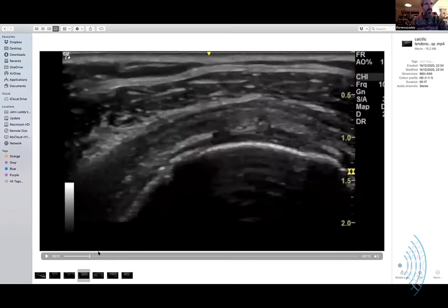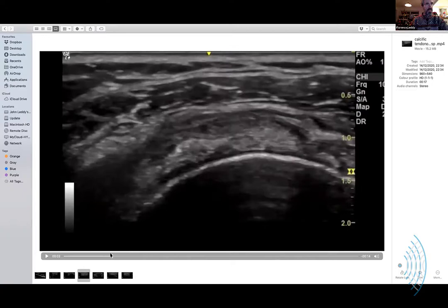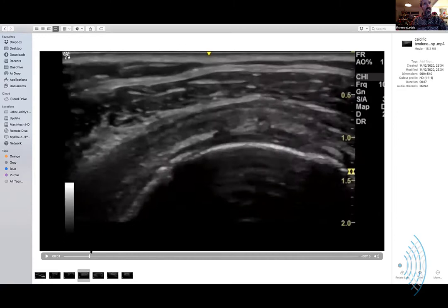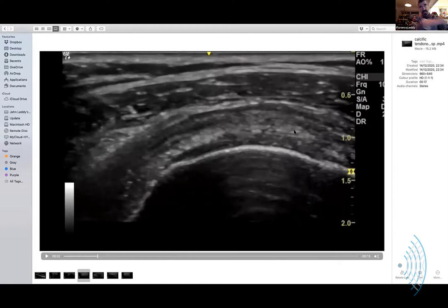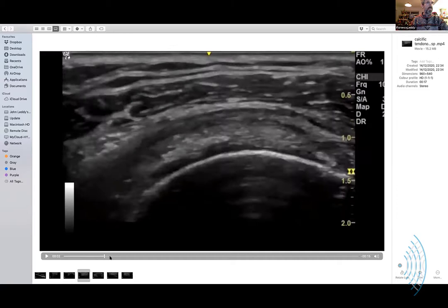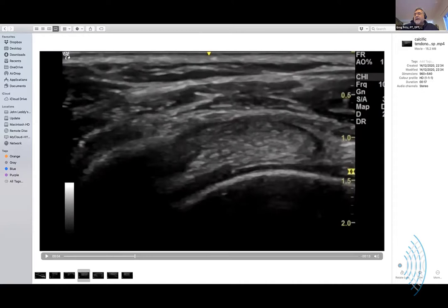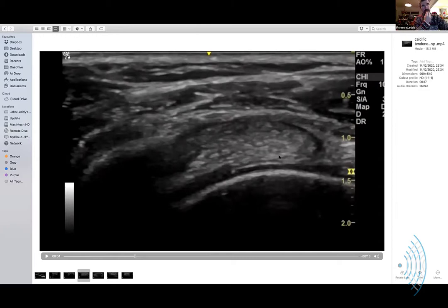You can see the fibers underneath going sideways toward the insertion. The anterior portion of this is the cape - the anterior tendon. As we go in - let me whizz all the way through to find the best bit. Here as you're heading toward the insertion you can see some of the fibers stop going forward and start going to the side. In the body of the tendon we've become more proximal. You can see the articular cartilage underneath.